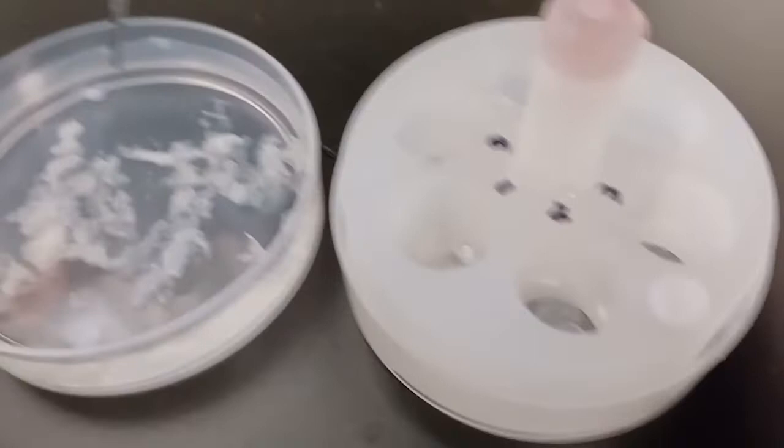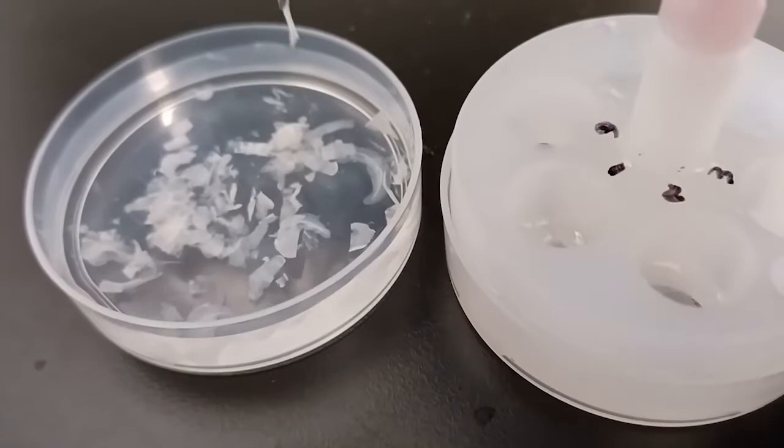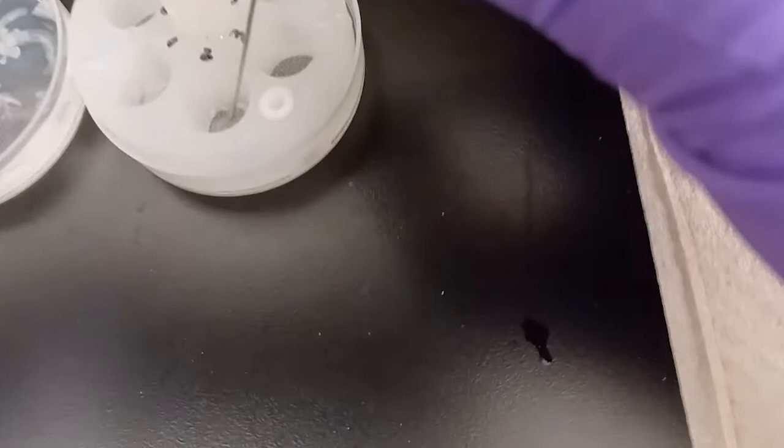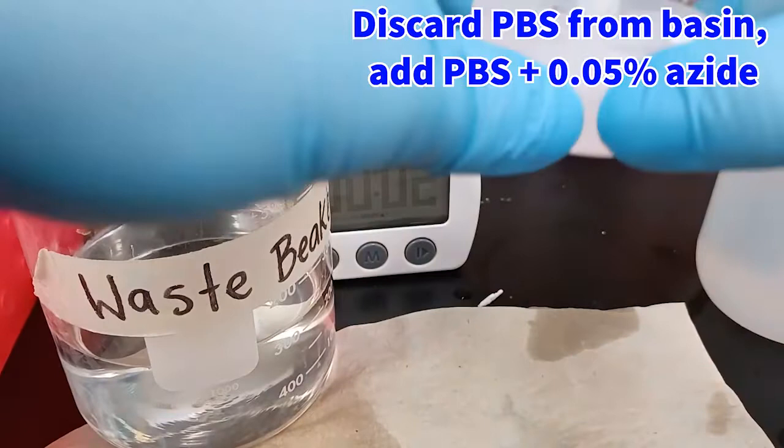When sections are all in a giant clump in the basin, it's important to tease them apart and get single sections separated out from the others. I'm also selecting specific parts of the brain where the sections are coming from, in case I have sections that go across the entire brain. If they get a bit sticky on the paperclip, you can shake them off in the netwell.